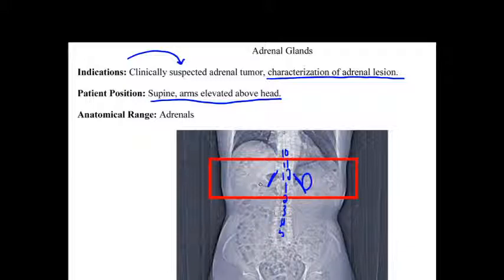So if we say that the kidneys are situated here and the right kidney is slightly lower, we're going to say that the adrenal is somewhere around this area. And so we need to at least scan T11, possibly even go up to T10. So somewhere around the vicinity of T10 to, let's say, around L2 or L3 should get you where the adrenals are.